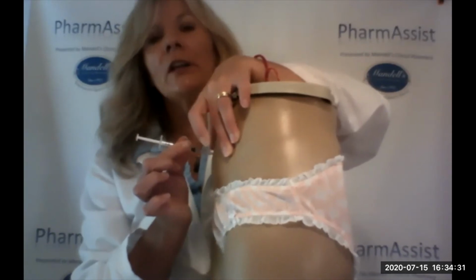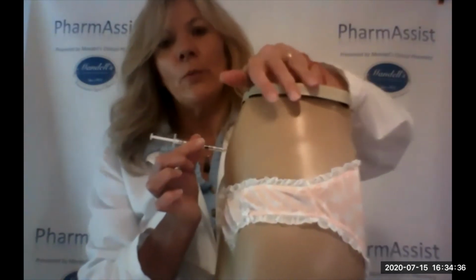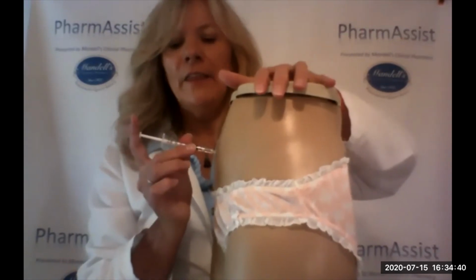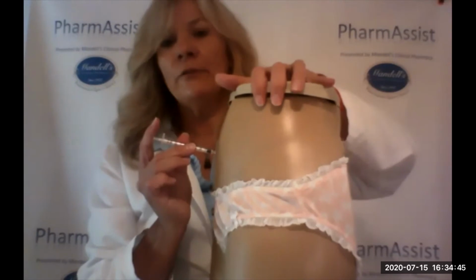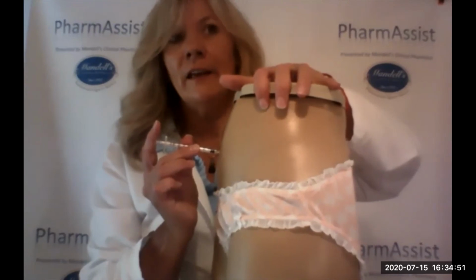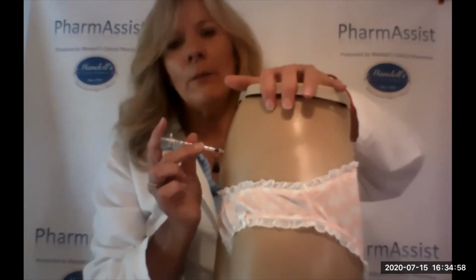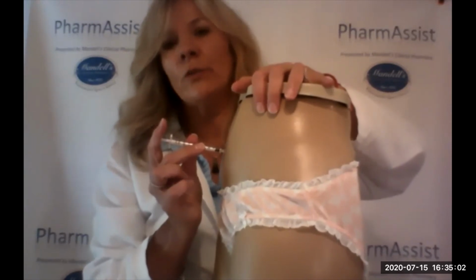There's where you will feel your mosquito bite. That's exactly what it feels like when those little needles go in, a little quick mosquito bite. Now you don't even feel it. Then we press that fluid in there. And with multi-dose, you probably will not even feel that medicine go in. Most patients that I speak to after I've taught them their shots, they'll say, wow, I was really surprised at how little you said I would feel, and I actually really didn't feel anything, and I thought I would feel a lot more. And that makes me happy, so that it reassures them and reinforces what we're teaching.